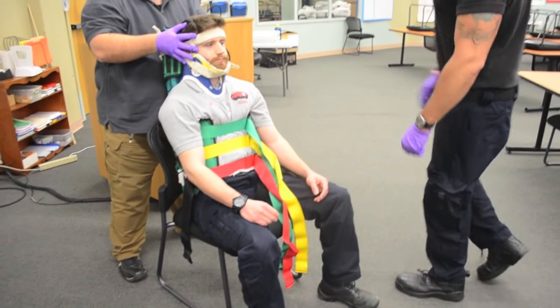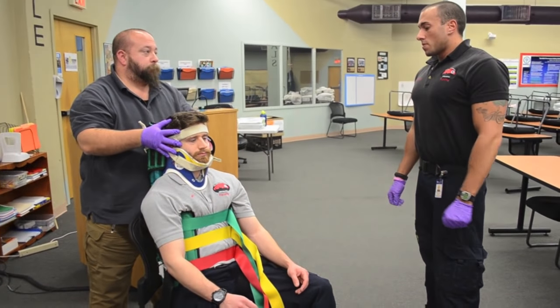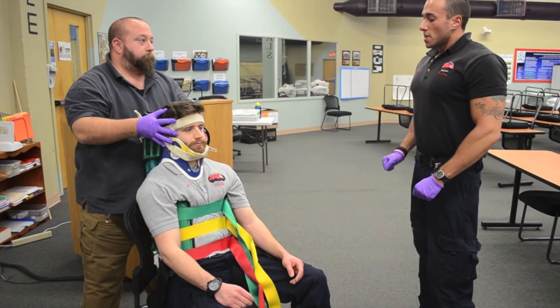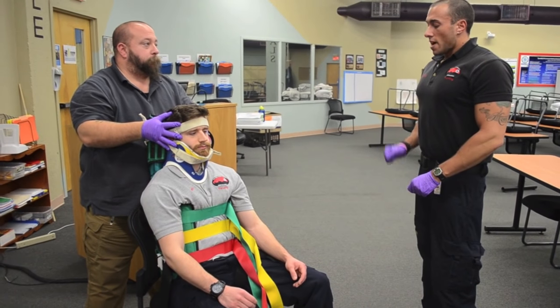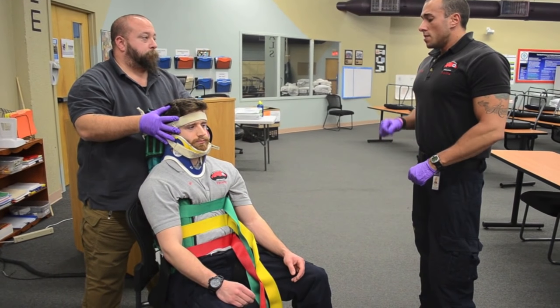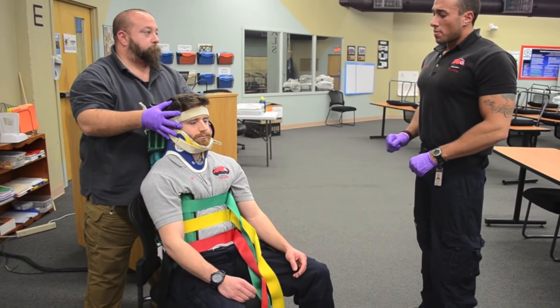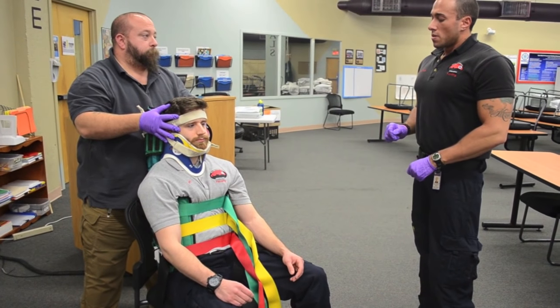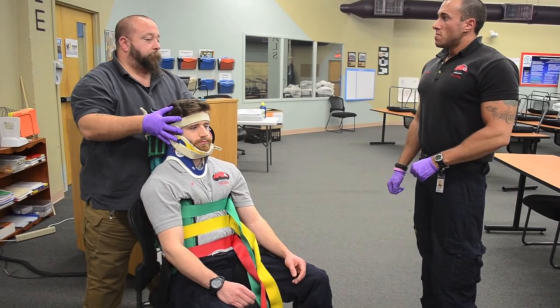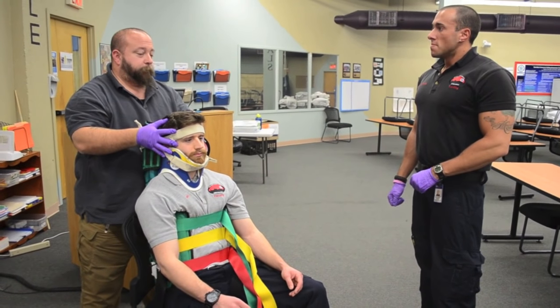Now that the patient is fully secured to the KED device, I'm going to move him onto a direct longboard. After we do that, we're going to strap him in — middle, butt, top, legs, head. After he's secured to the backboard, we will re-check PMS. I have successfully completed the station.